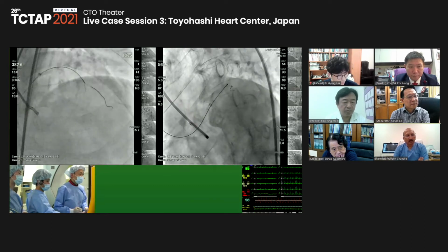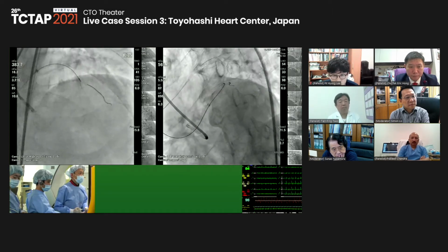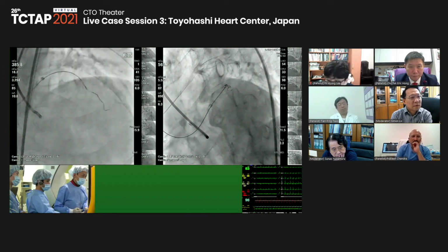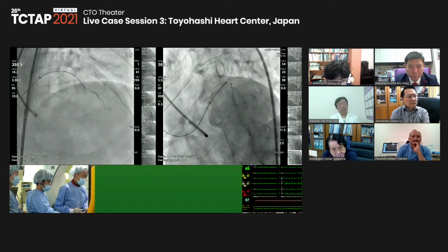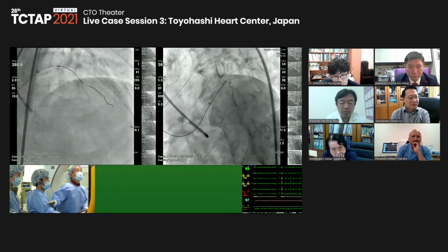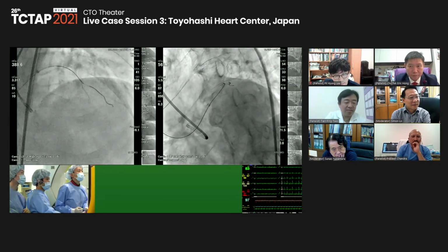So ideally, I want to get the small diagonal inside the CTO side, and then check with IVUS or something after small balloon dilatation or the Corsair passing. But now we can get the small branch. Maybe this is the diagonal branch.